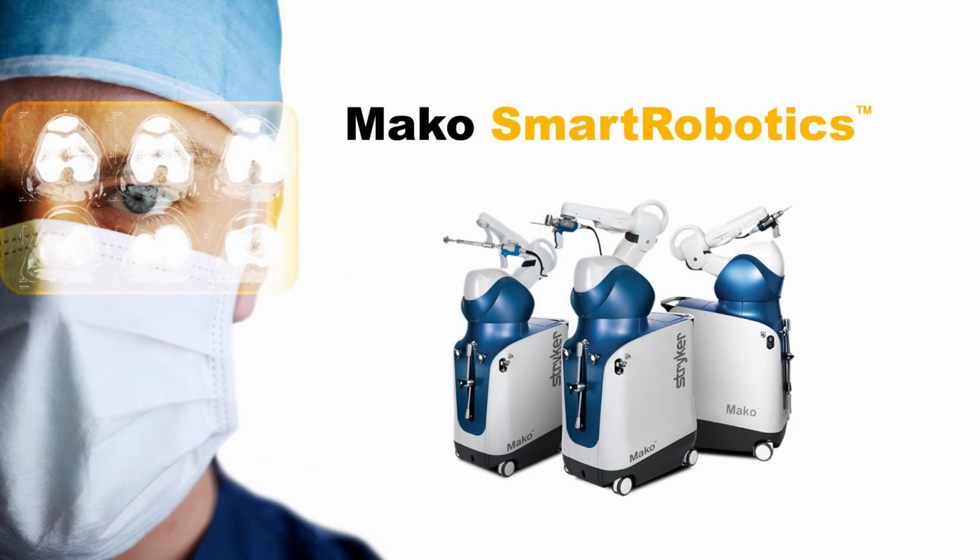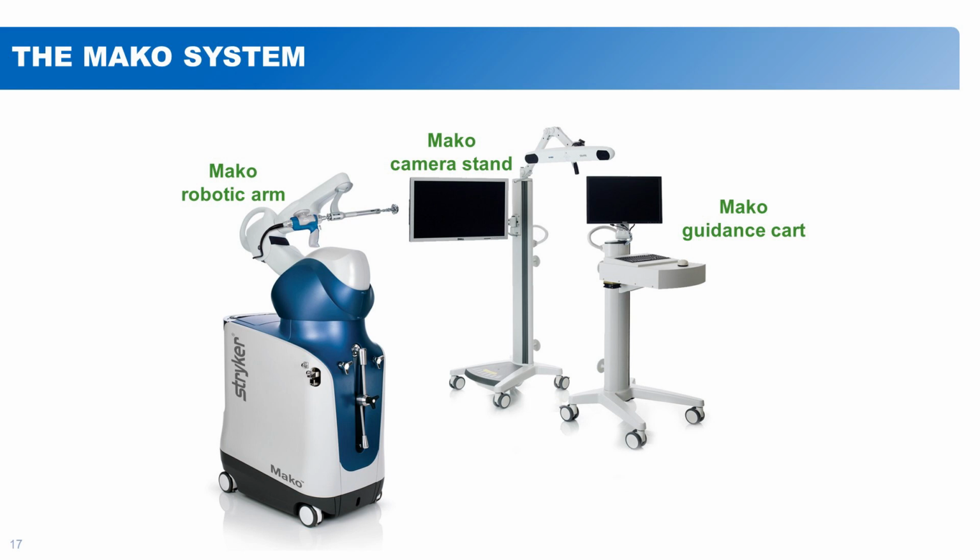So the question is, how can we do this better, and how do we use technology to help you get on your feet quicker, reduce complications, and get your life back? What the implant manufacturers and Stryker, Mako have afforded us over the last 10 to 15 years is robotic technology. The robot is basically a robotic arm that is non-autonomous, meaning that the robot can't do the surgery by itself. It still needs a surgeon to do the surgery.